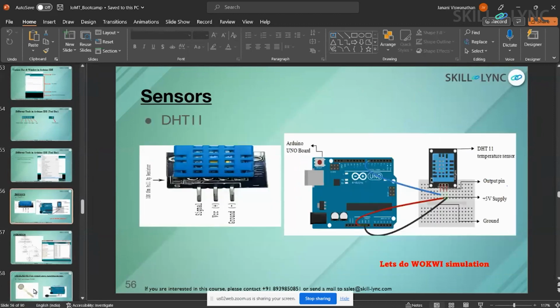Okay, so the basic physiological monitoring parameter is your temperature. Your temperature is a physiological parameter which is going to tell you the homeostasis condition, meaning the equilibrium condition of the patient or the person. If your temperature is low or high, in both conditions, it means you are affected by some kind of disease, correct? So for doing temperature monitoring, I am here for prototype purpose.